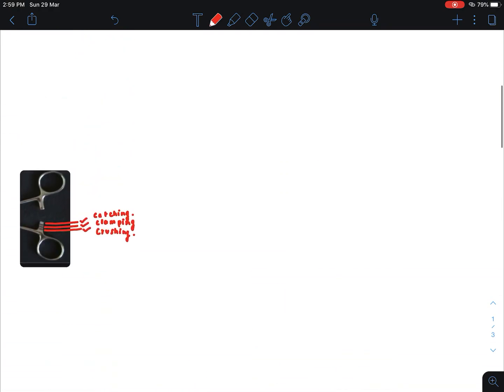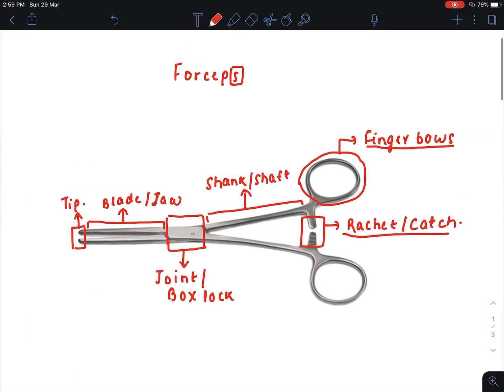So I have discussed the parts and the types of serrations of the surgical instrument. This is the first video of the surgical instruments series.